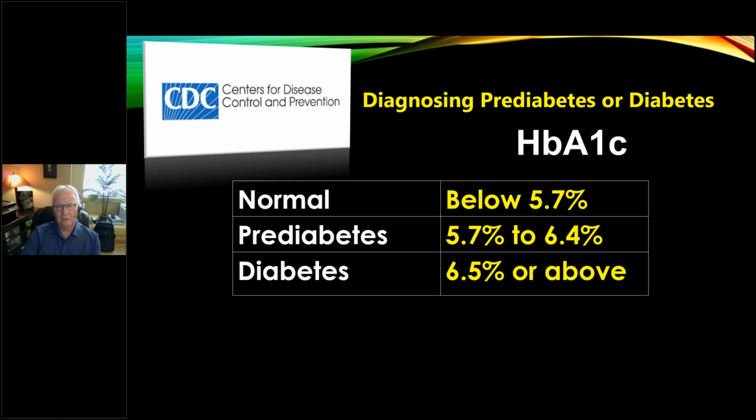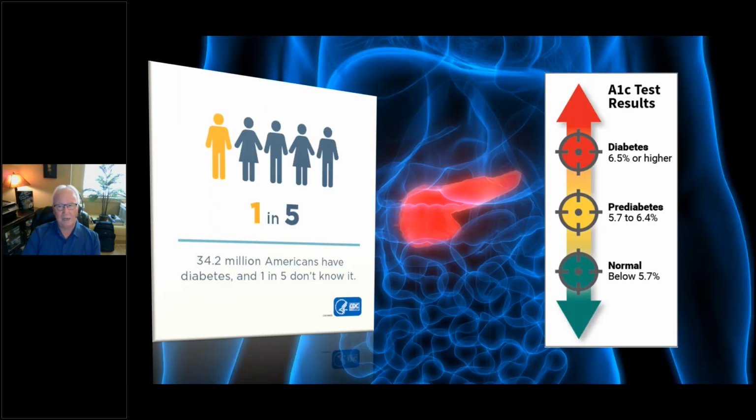What I'm surprised to learn is there are clients of mine, periodontists in particular, that actually do this in their office, okay? They actually do a hemoglobin A1C in their office. And I'm going to show you why, when you identify something in your cone beam scan, you should think about ordering it or maybe even doing it in your office, because almost all the carriers cover it under a CDT code, D0411. So we're going to give you the 411 on diabetes in your practice.